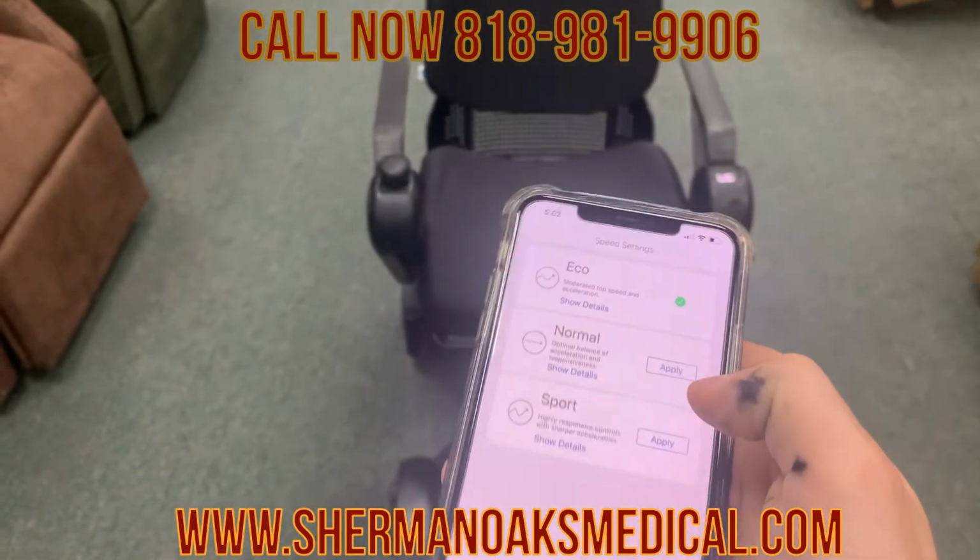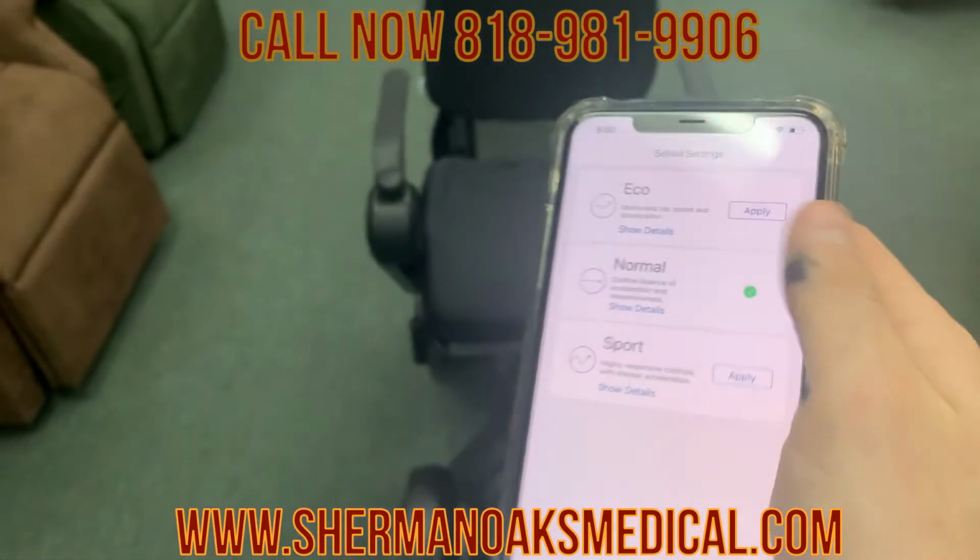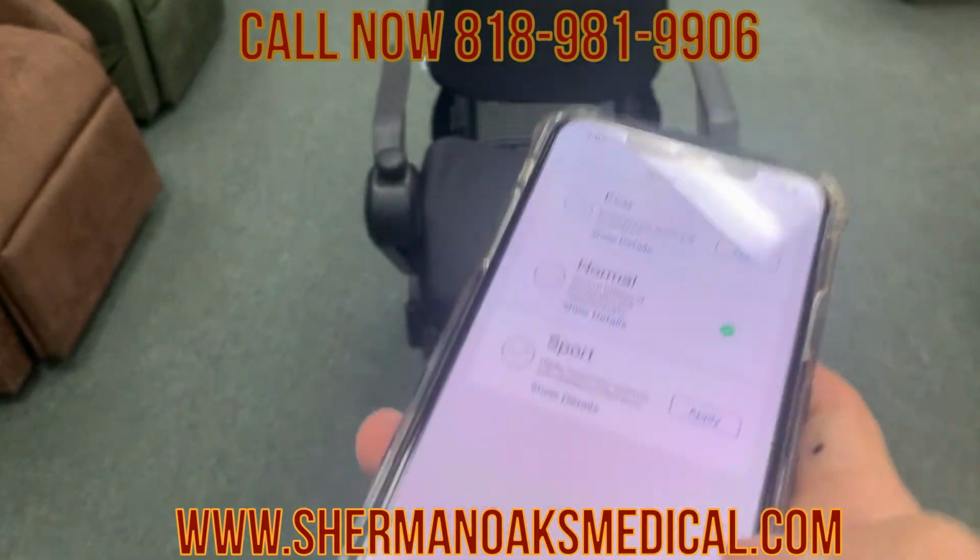These can be changed anytime and applied right in the unit. And your 1 to 4 settings do change with this as well. So that's just important to consider.